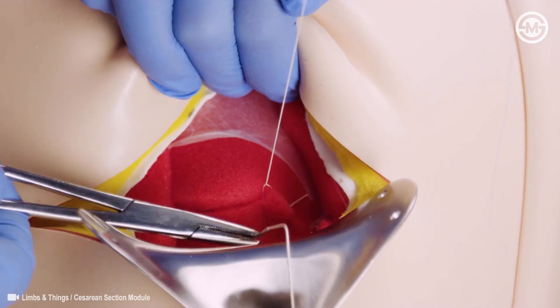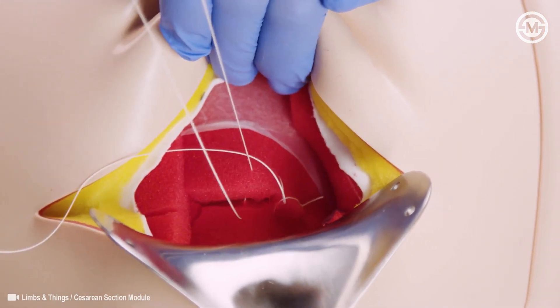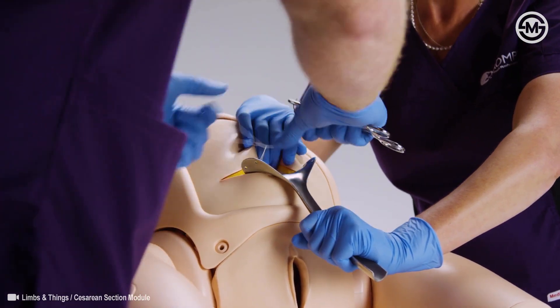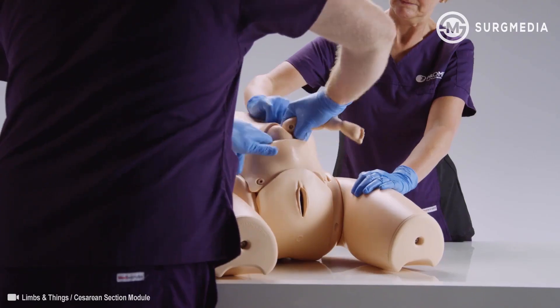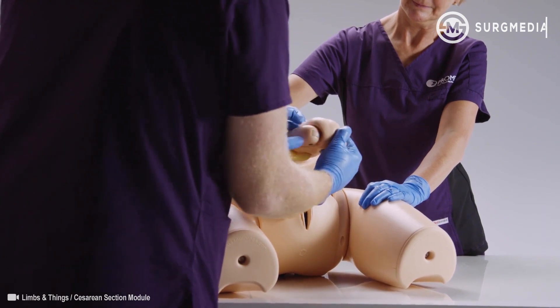Layers can be sutured along with in-situ repair of the uterine wall. The pre-incised delivery skin provides a durable and realistic full-term abdomen, making it ideal for repeat practice of difficult deliveries.